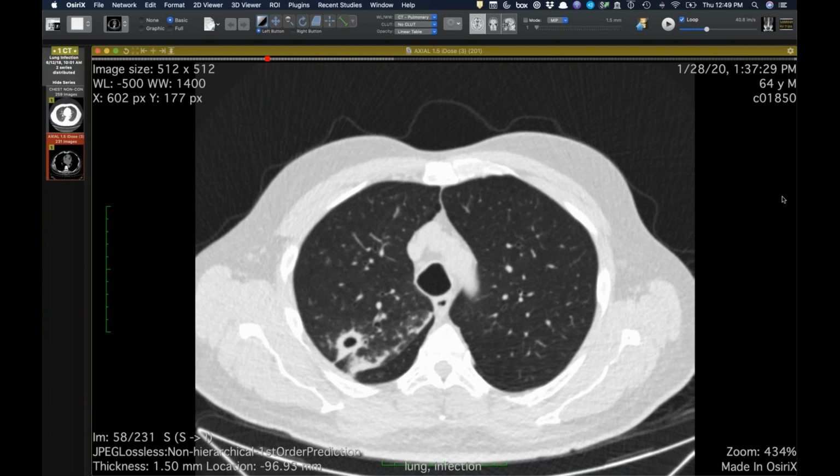So I think part of it is what stage are you at? How long has it been there? But inhalational things are usually worse in the right upper lobe in this region. And that's because the right bronchus is the shortest bronchus. If you want to get immediately into lung, you take the right upper lobe bronchus. Even coal workers' pneumoconiosis, if you look at the B-Read standards, they show usually worse disease on the right than the left. And I think it's because things that are inhaled go to this region preferentially.